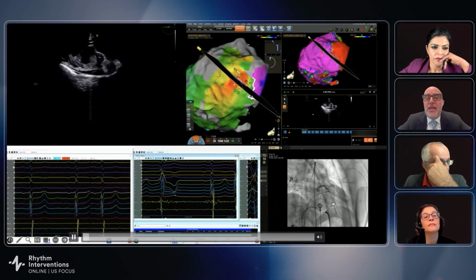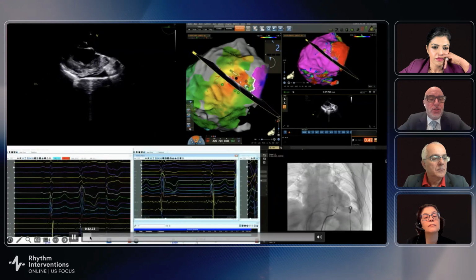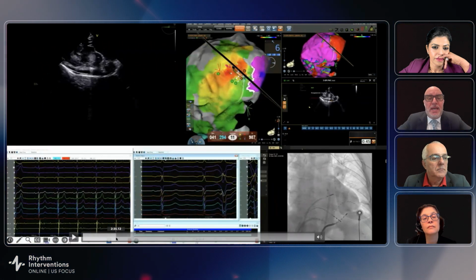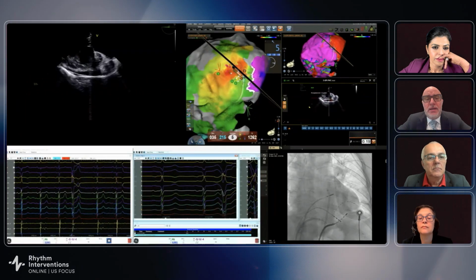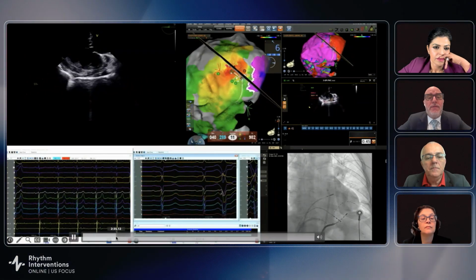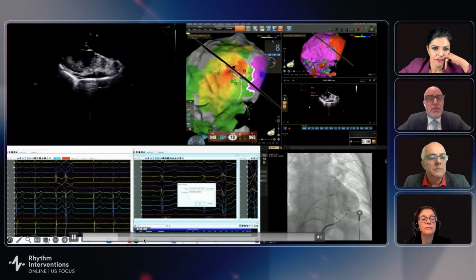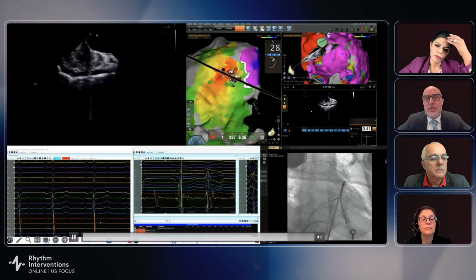And that was the area that had the best activation and pace map. That was the coronary angiogram, as I just showed you, from a distance, and then right there after careful mapping, we decided to perform ablation. And you will see here that when we find the best area of activation on the epi, we apply RF, and once we apply RF, the PVCs went away, and what you're having is a completely different PVC. So it was really complete elimination.